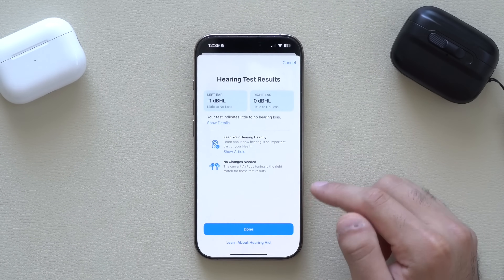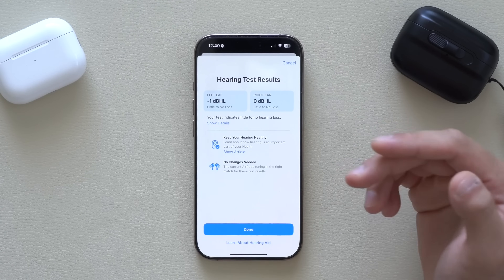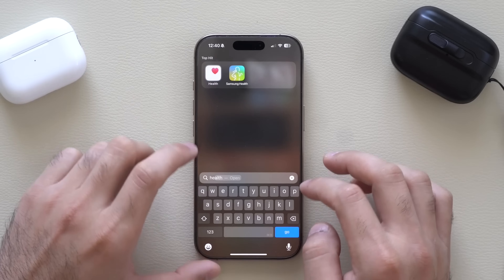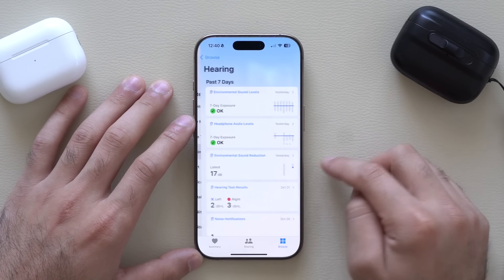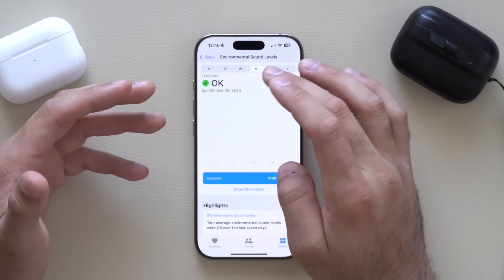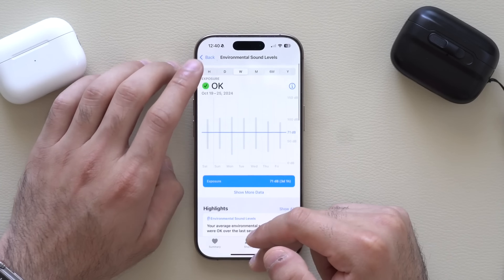Once done, tap Show Results and it will display your results. It looks like there's no change — no hearing aids needed. Once you're done, the Hearing Assistant is turned off. But if you go into your Health app on iPhone, browse to Hearing, you can see your results there too and keep track over time. It's pretty cool that it integrates with the Health app to monitor your hearing levels as you age.